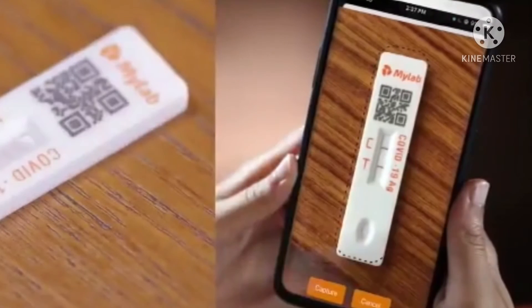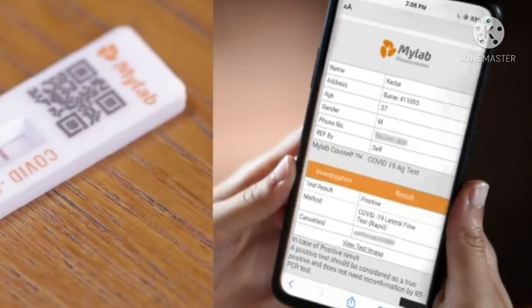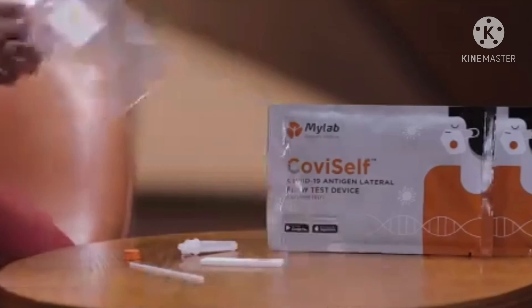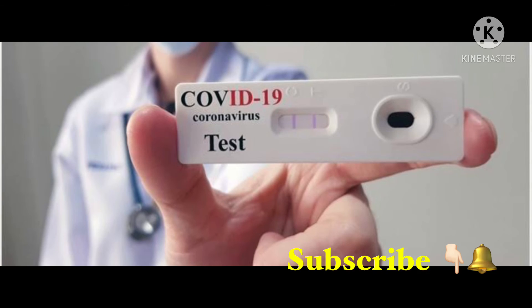After reading the result, you will use the camera in the app to capture a photo of the test result. Before you download the details, you can submit the photo through the app.